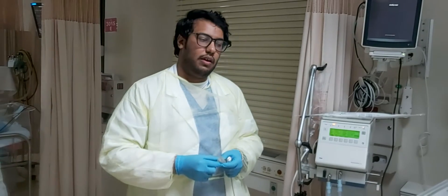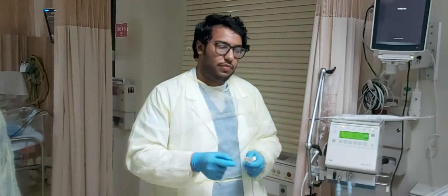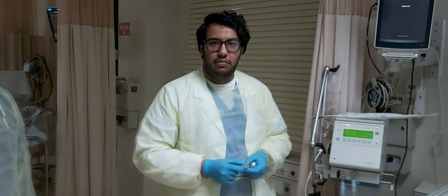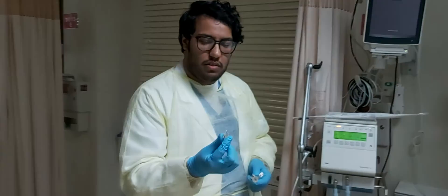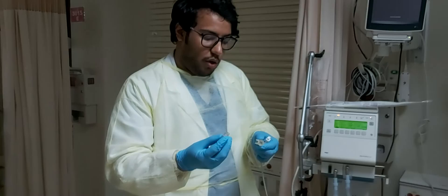The flow sensor is the device used to measure the gas flow between the patient and the mechanical ventilation. And we have this, which is the flow sensor.